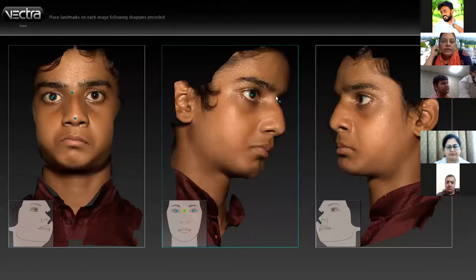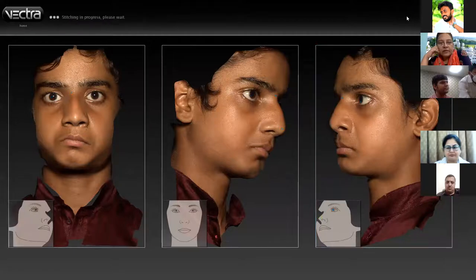Many patients come to us with ear defects, so our focus is on capturing the ear properly. We still need to optimize it for scanning or taking pictures of eyes, because many of our patients who are mucor infected have now lost their eyes. So we have to optimize and see whether it can work. The surface is good, but we have to apply it in various areas and check whether it is serving its purpose or not.